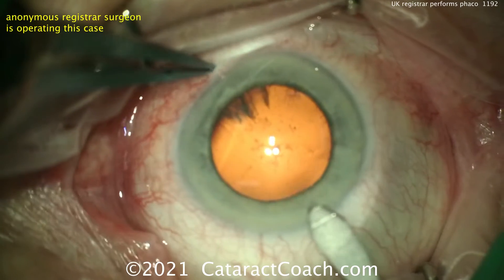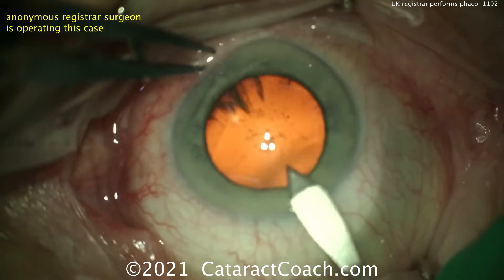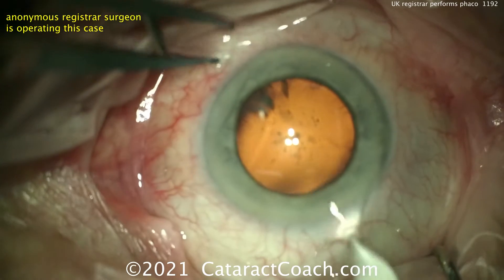Here's the main incision being made. The video's a little bit out of focus because these young surgeons have such great accommodation. I'm jealous.